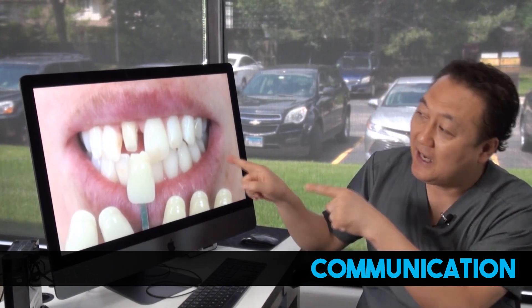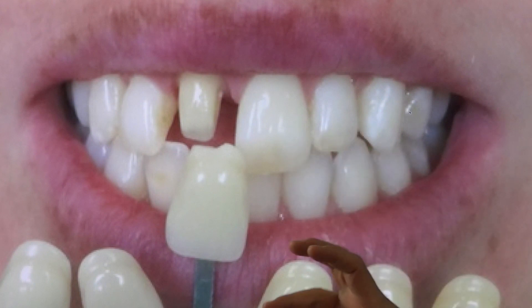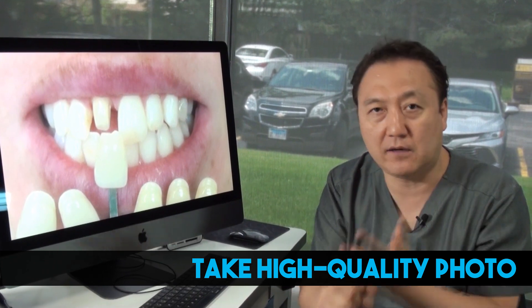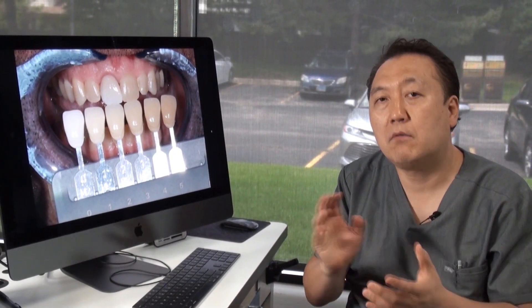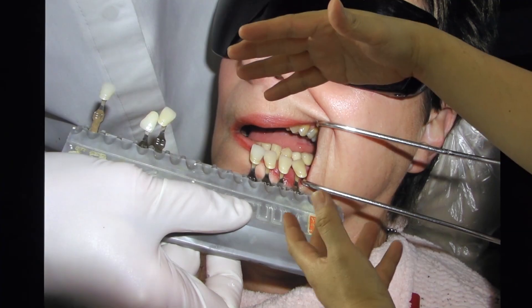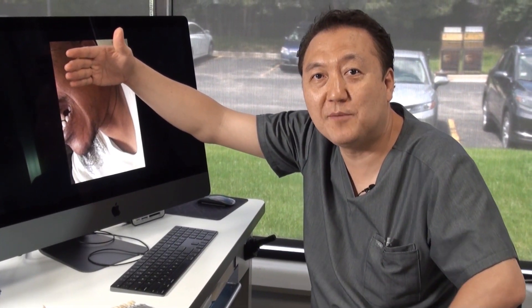Let's talk about the problem. Number one: communication. Like this — it's fuzzy, it's too bright, bloody. You cannot see clear definition. You have to take a good high-definition photo regardless of what camera you use. If you do not communicate correctly, the result is like this. One of these miscommunications is the photo is taken too far. I want it a little bit closer. This is a miscommunication — I have no idea what they want. Please do not send me photos like this.